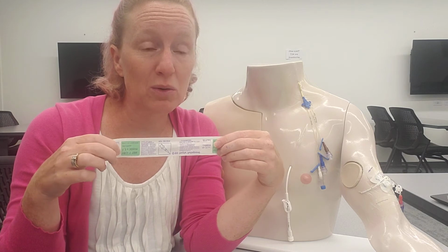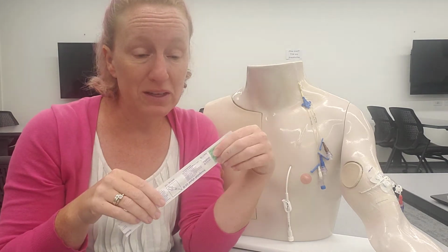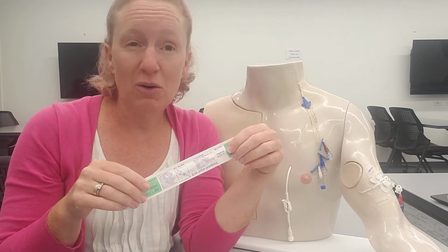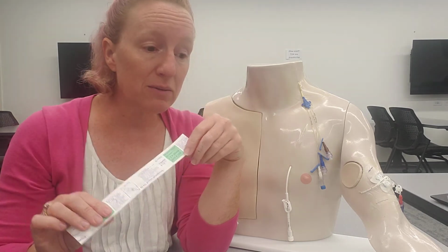If you have a little old frail patient with real soft frail skin, you're probably going to pick a smaller gauge needle. You don't want to puncture that big of a hole in there. But if you've got somebody who's like a firefighter and good and healthy and they're bleeding out, I want a bigger gauge needle. So it really depends.